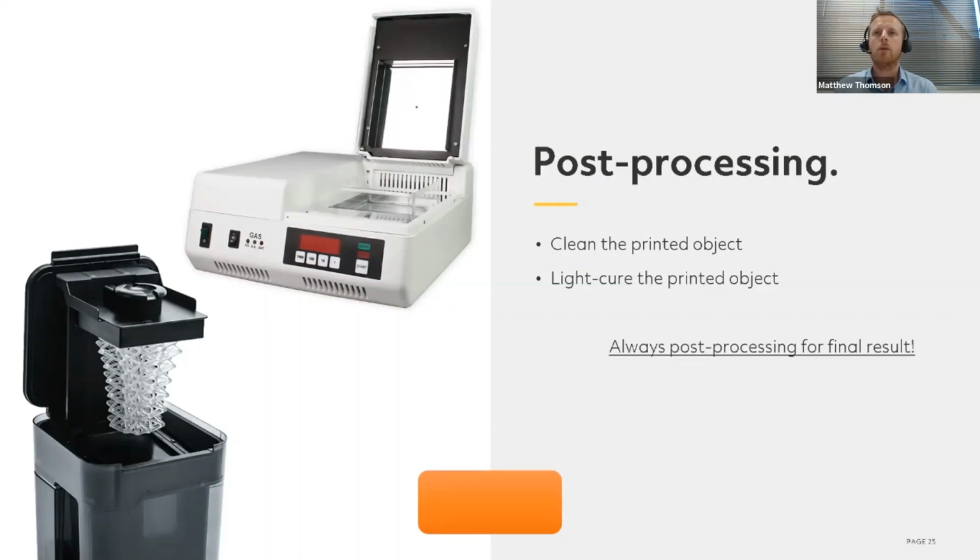So for example, with Ceremco, the Swiss company that make their thick, very strong denture material, that's a liquid resin that's got little glass beads inside it. Beads, you think, oh, maybe it's the size of a necklace. They're actually really, really tiny, down at the 100 to 50 micron or even smaller level. These glass beads and the really thick resin ensure that you have a really strong result when you post-process it correctly. So for Ceremco, you have to use an Asiga because this is a printer with the power settings, the exposure settings, and so forth that have been validated by Ceremco, and then all CE, TGA, FDA, etc.